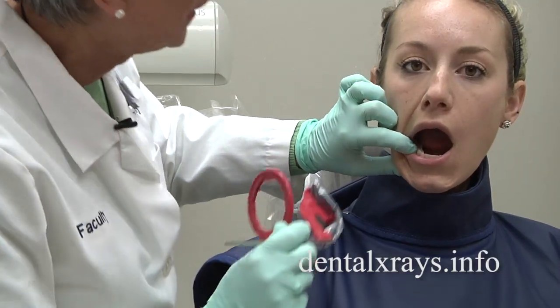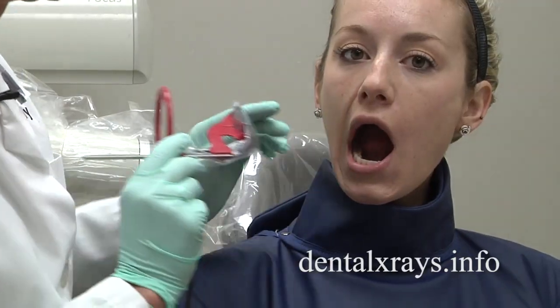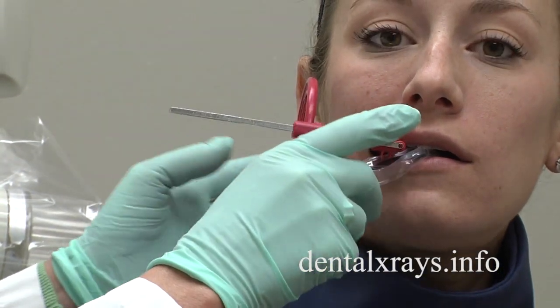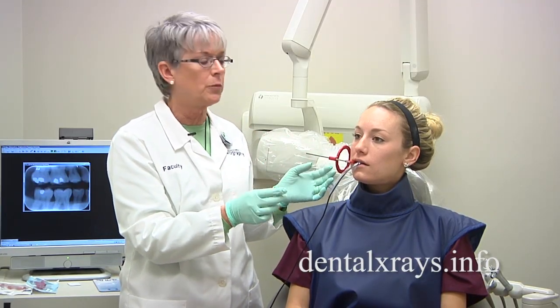So if we open up her mouth and I look at this, often the molar view isn't going to require anything except moving it toward the middle and putting the distal of the second molar on and having her bite down and bringing the cone and taking that. That's all you need to do for the molar view.